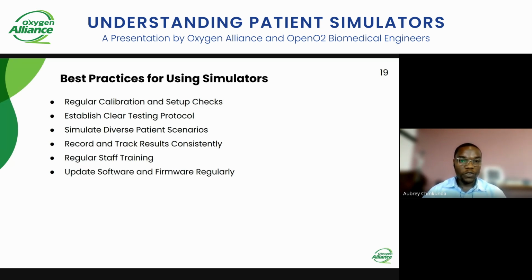Make sure you record and track the results consistently. These are very good for, as I said, accreditation and audits, and also reporting. Make sure you track and record everything. It's something that will also help if that device malfunctions in future. You can always have a history that, okay, we serviced this device like 3 months ago and this was the problem. So it will give you a starting point.